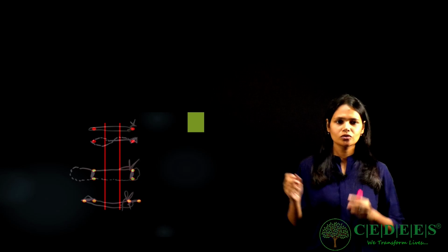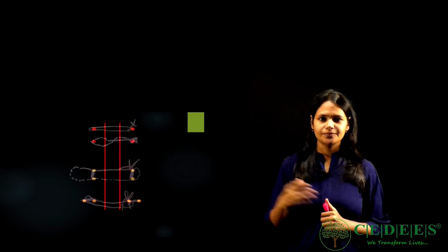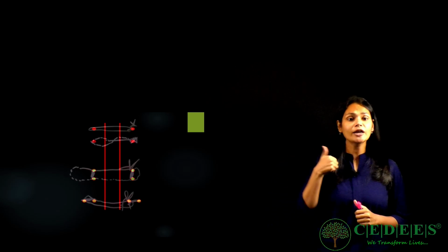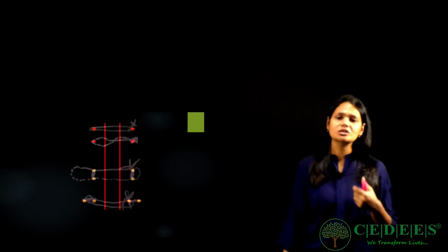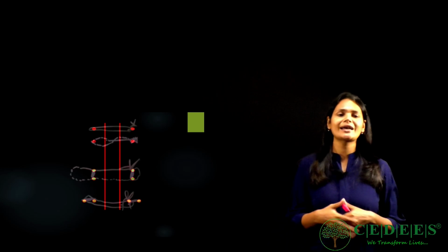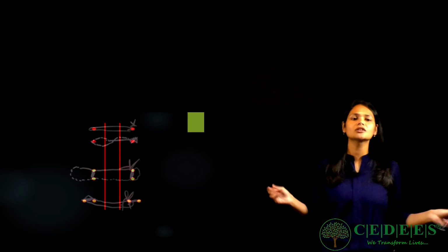I hope that you know just the incisions I have covered in a separate lecture. But the first incision, second incision, third incision, why do we do flap? Just for access. It's not a magical procedure. We just need to reach there. Our conventional instruments like curettes or for that matter scalers don't reach deep inside more than 6 mm pocket. So that's when we do flap surgery. We open it up, we clean it and we close it.